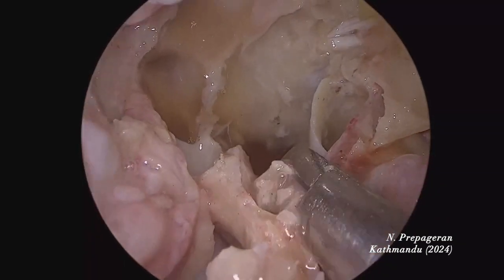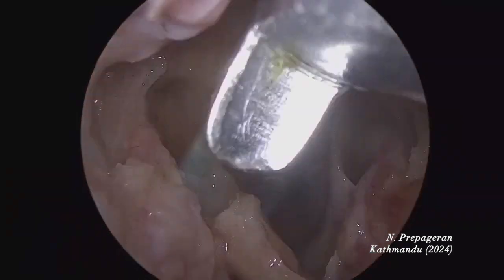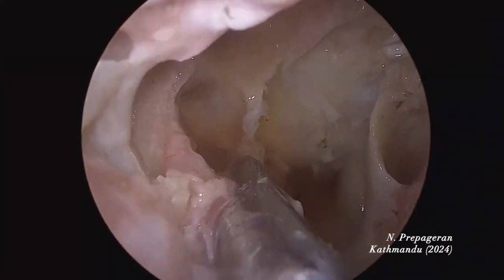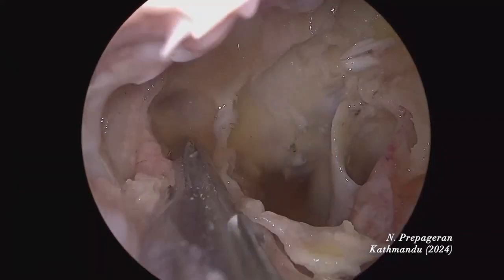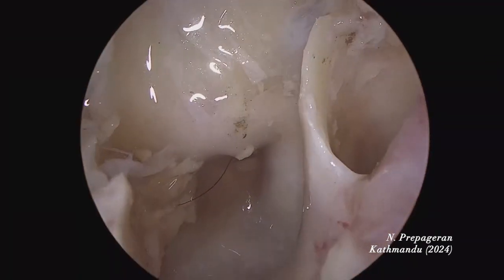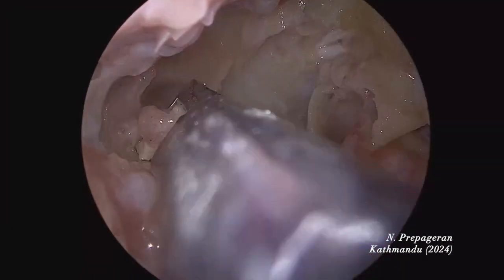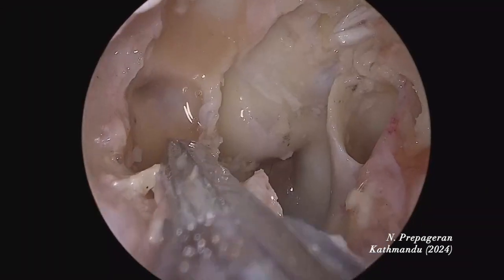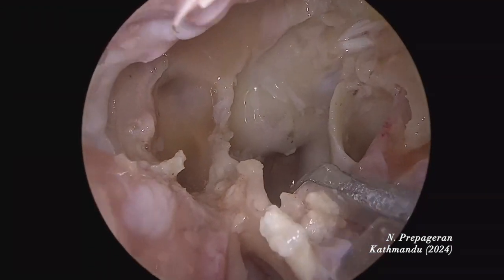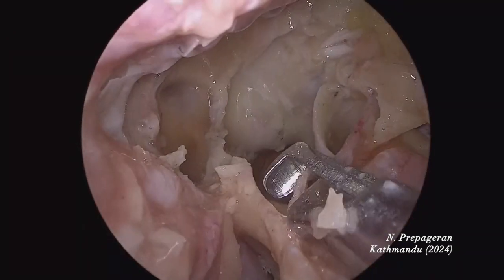Look at how abnormal this keel is. I can't see the clivus here. Let me expose a bit more by removing as much bone as I can so we can visualize the clivus. I can see the paraclival carotid already. I need a bit more exposure — we have an abnormal sphenoid anatomy here. Once you've identified your friend the optical carotid artery recess, we can now continue with the dissection.